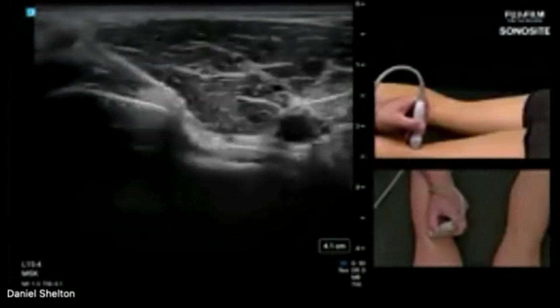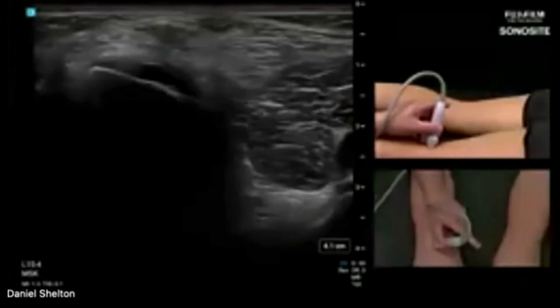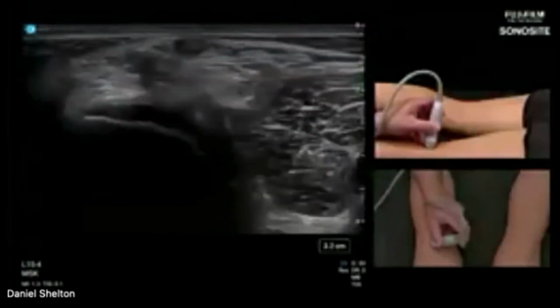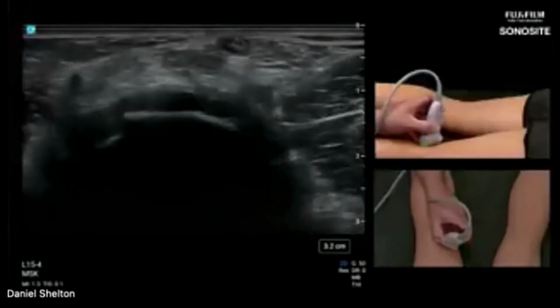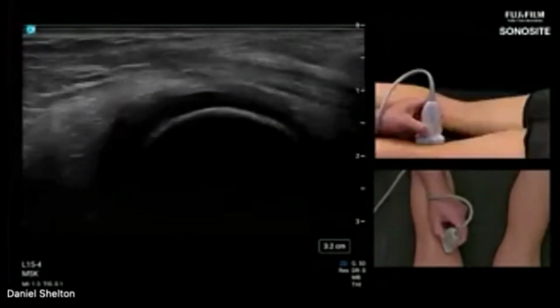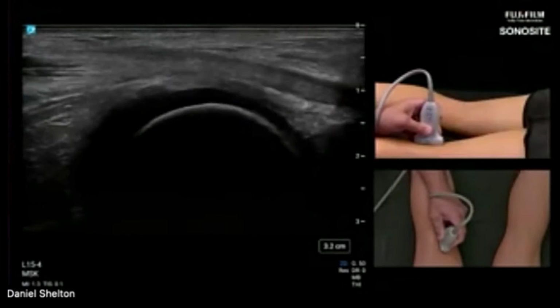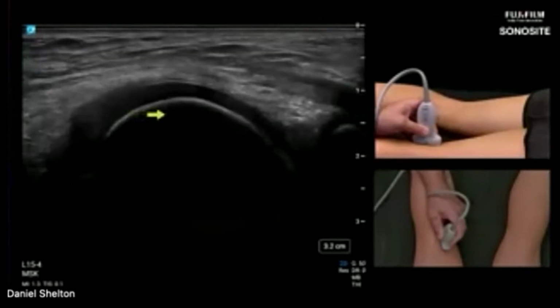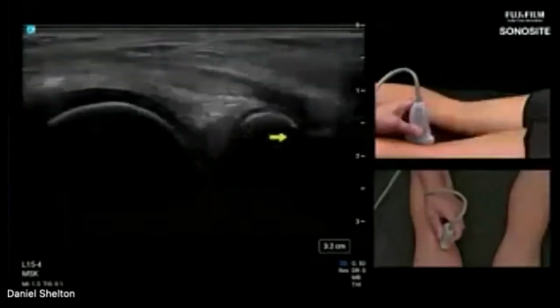So now I'm just going to take my transducer back over to the medial femoral condyle, bring my depth up 2 more clicks, and then what I'm going to do is just rotate the transducer. Left side of the screen will go proximal. I'm going to keep my bony reference on the screen. Here we go. So I kept the femoral condyle on the screen. It's the most recognizable. So femoral condyle, here's that articular hyaline cartilage cap. Okay, we can see very clearly the margins of the cartilage. I can chase that cartilage down. We can see the border.